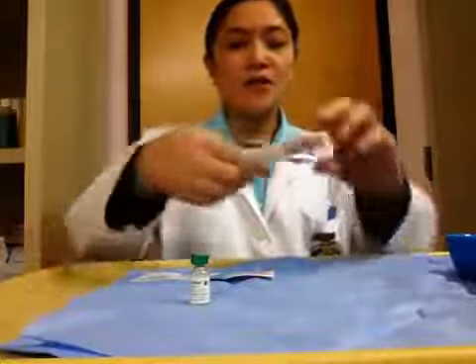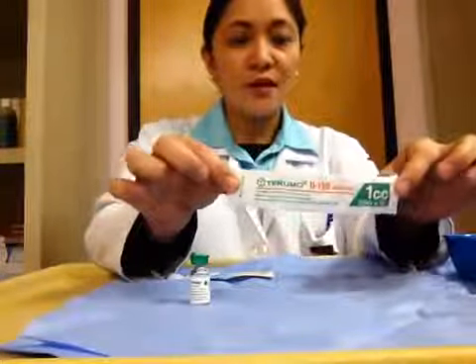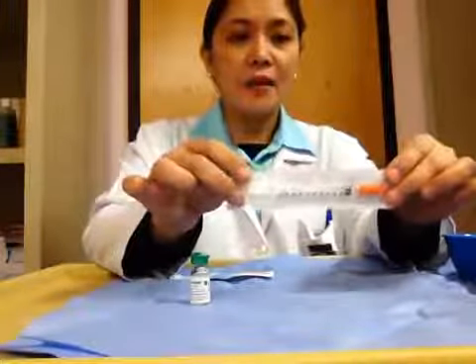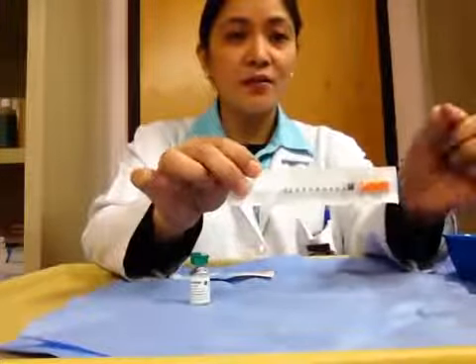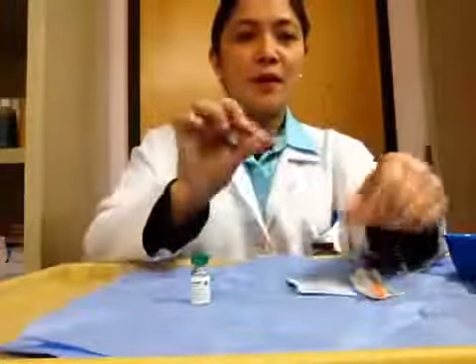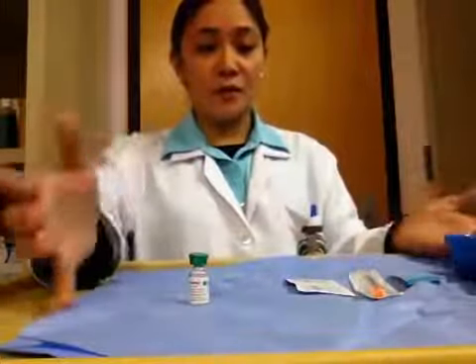And of course, we need an insulin syringe. This is a 1 cc syringe with an attached needle, gauge 29, a very fine needle. You can also use any other 1 ml syringe in giving subcutaneous injection, as long as the needle you're going to use is gauge 25 or even smaller. Of course, we need the alcohol swab and the band-aid that you will apply to the patient's site of injection after. Okay, after thorough hand washing, we prepare this medication and equipment.